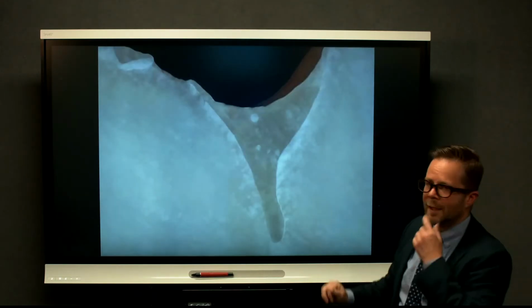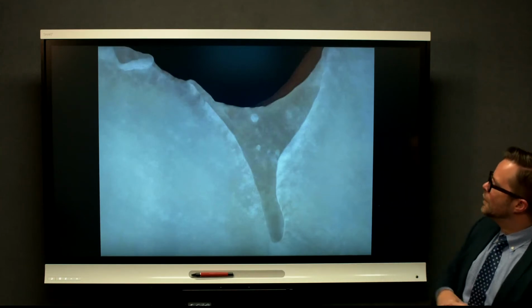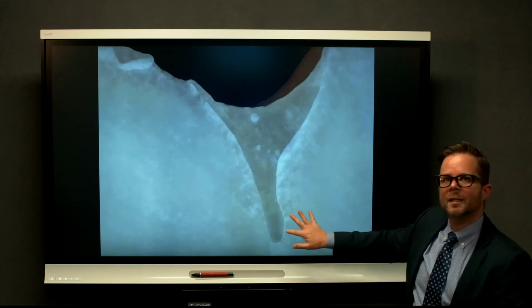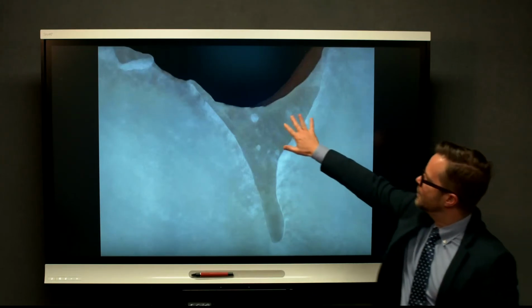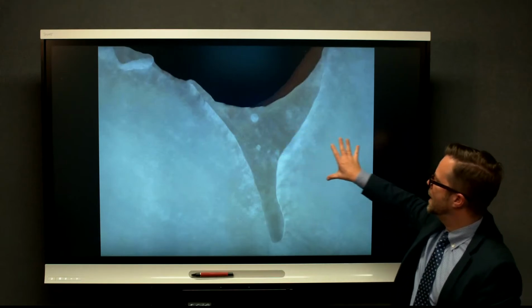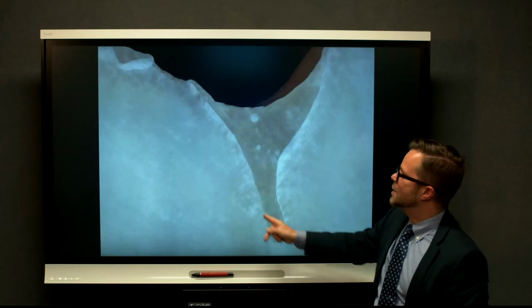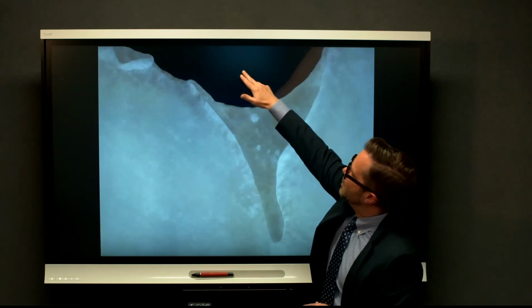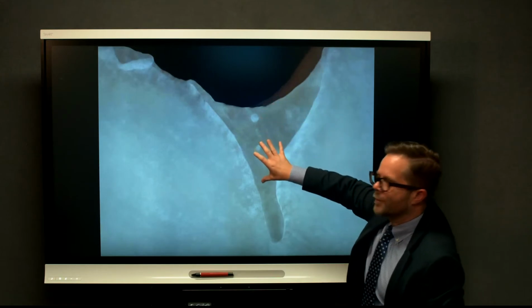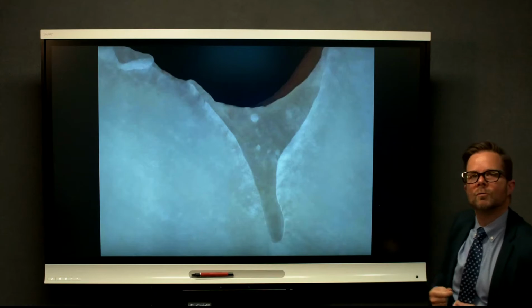Okay? Now here's a really nice picture of a tooth that has had a fissure sealant placed and has then been cut in half so that you can see the material here, resin composite, and you can see the enamel here. And you can see this one is beautifully sealing. Here's the mouth up here, sealing off the mouth from the base of that pit and fissure where the toothbrush bristle couldn't reach.